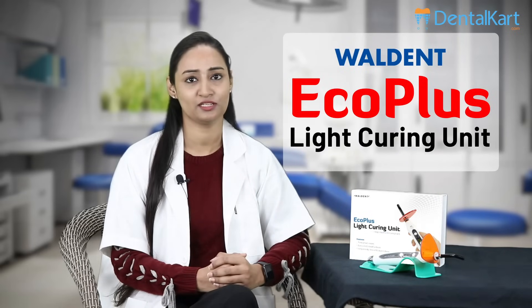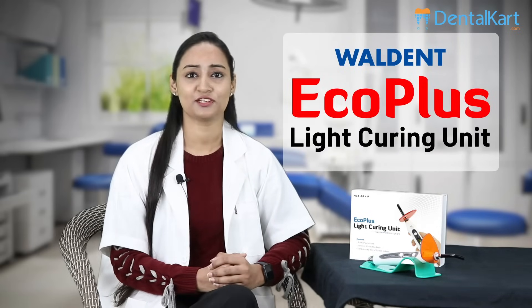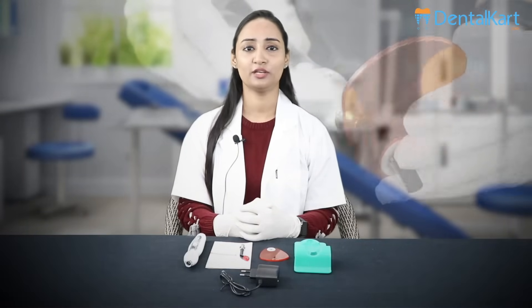Hi everyone, this is Dr. Shivali from Dentalcart. Today we will be talking about the Valdent Eco Plus light curing unit and we will also be demonstrating its uses. So let's get started by assembling this LED light curing unit.